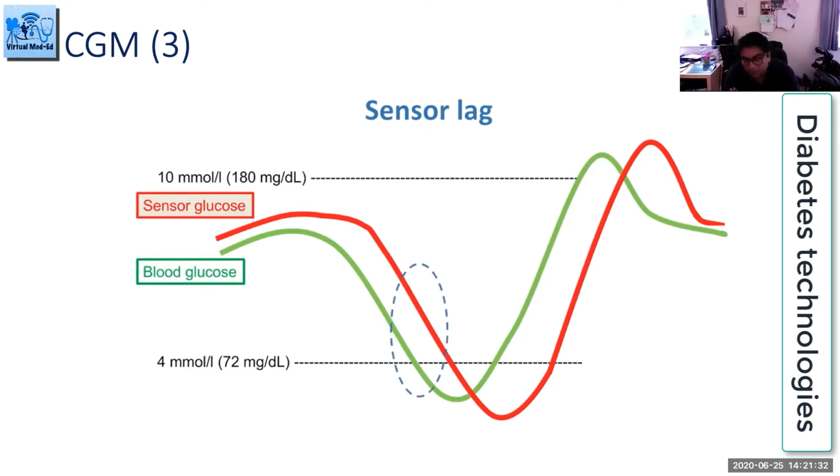It doesn't tell me exactly what it is, because they don't understand that what we're measuring is interstitial glucose. There's always a lag. Particularly if the delta change in glucose is rapid, in other words, the drop or the rise in glucose is very high, the lag is even more significant. And those are the areas where patients find that, oh gosh, it's really way off, and that's to be expected.